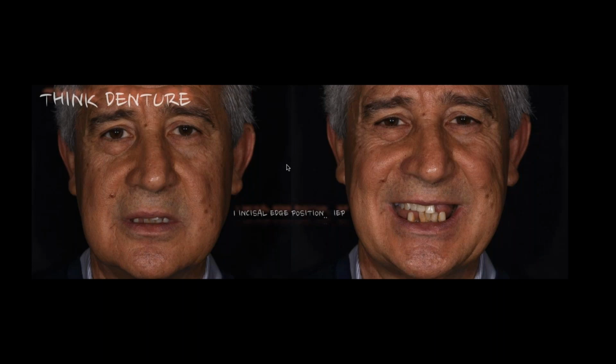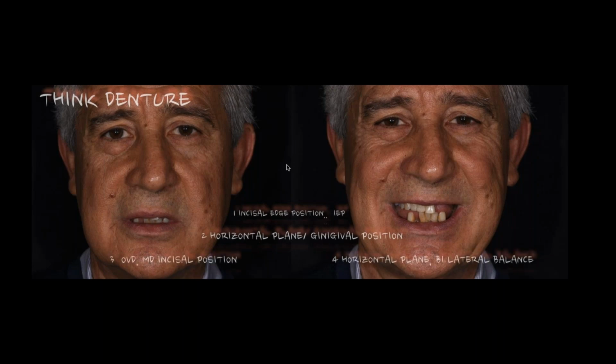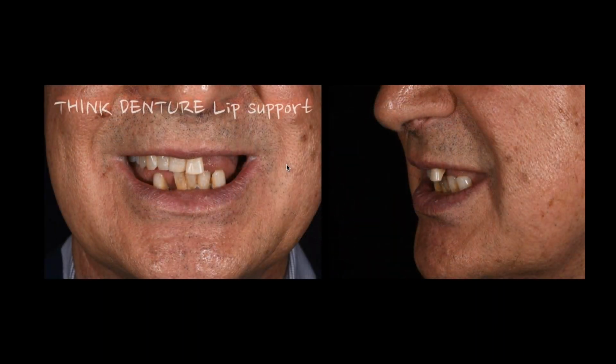Once I've been able to figure that out, then it becomes a lot easier for us to say, okay, I see where I want the incisal edge. I see where the horizontal plane belongs. And now I'm going to work through my occlusal vertical dimension, my envelope, like we talked about last webinar, and try to figure out where the teeth belong. I also have to think about the lip support. Will my restorations, be it full denture, partial denture, crown and bridge, implant related, be able to support the lip and the structure that I see there?